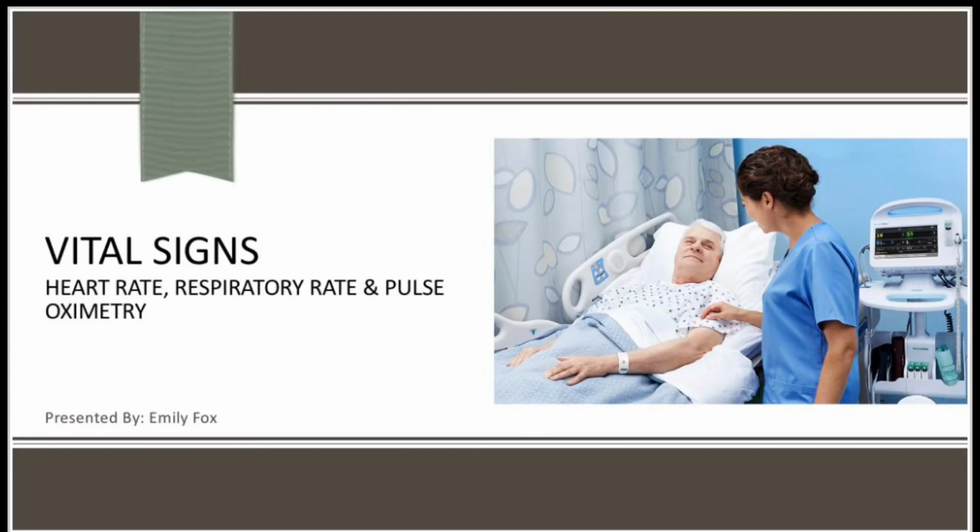Let's talk vital signs. Today, this is going to include heart rate, respiratory rate, and pulse oximetry.